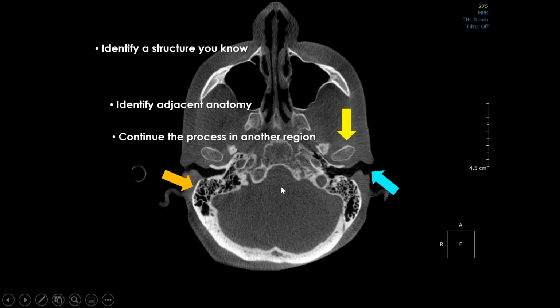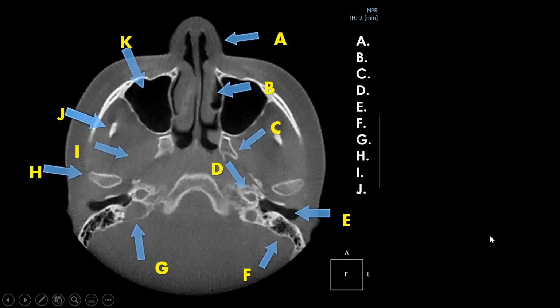What isn't familiar in these kinds of planes of section are some of these openings in the floor. This happens to be the jugular opening for the jugular canal, and there's the carotid canal. And here's the lateral pterygoid plate in this patient. So you need to study this, and this series is being recorded. When you revisit, or those of you who register and come later, you'll be able to watch me disclose these structures. And two or three times through this particular webinar, you should have all your anatomy down pretty pat.